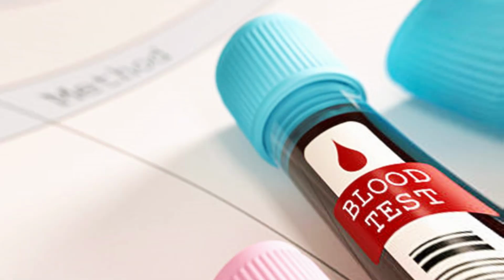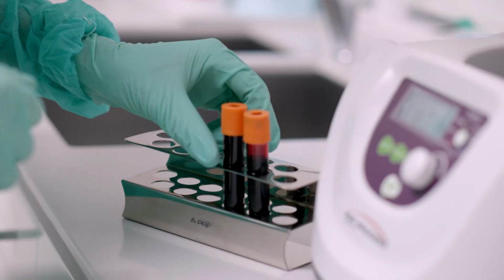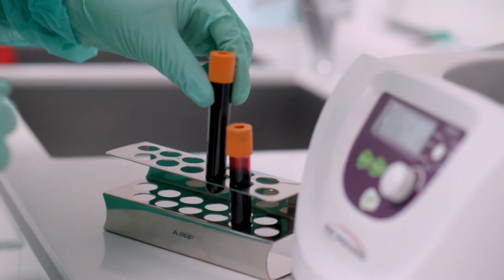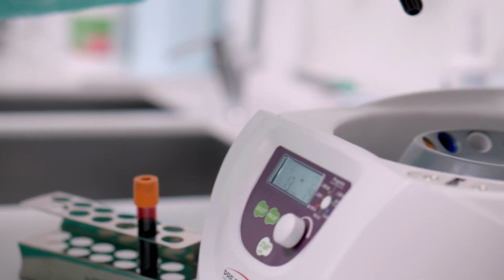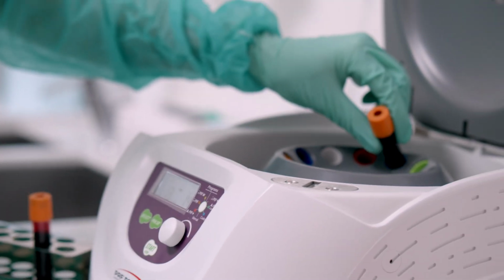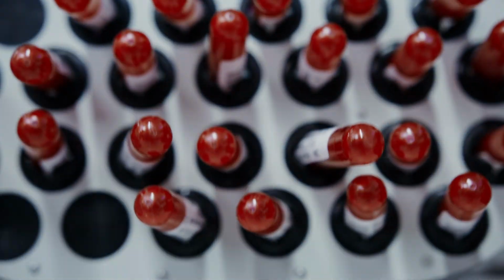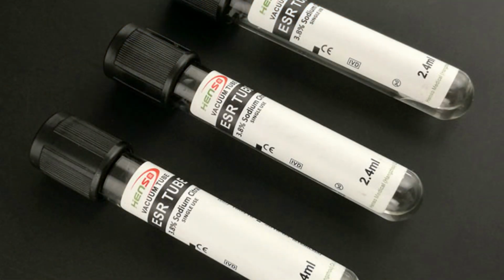Then, light blue top that contains citrate. Then, red or gold tube which do not contain any anticoagulant and is clot activator. Then, green top that contains heparin. Then, lavender or pink that contains EDTA, and finally, gray top that contains oxalate.